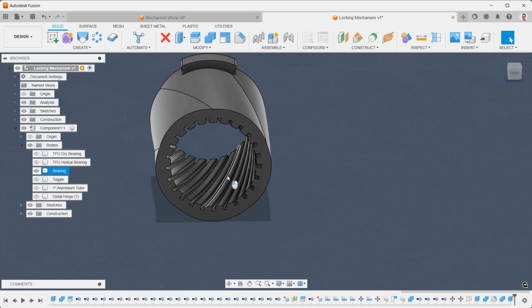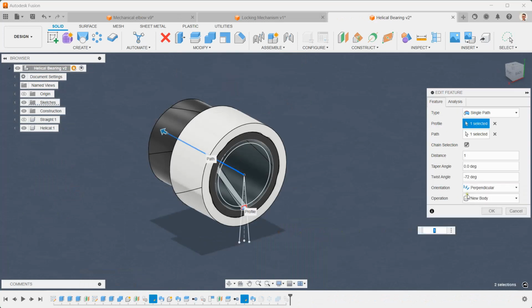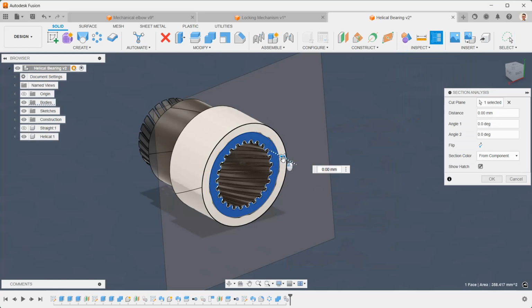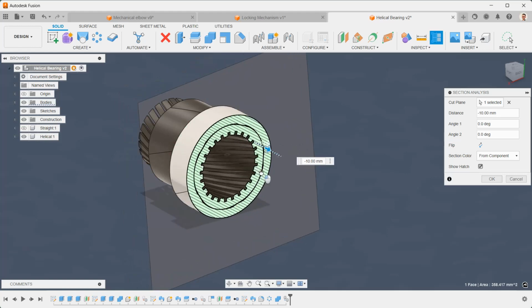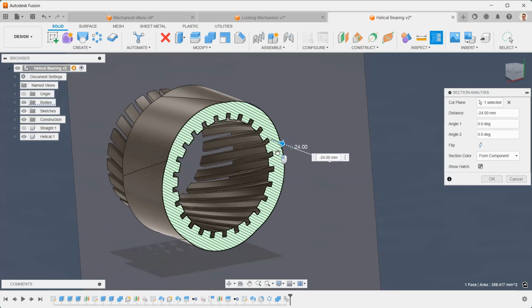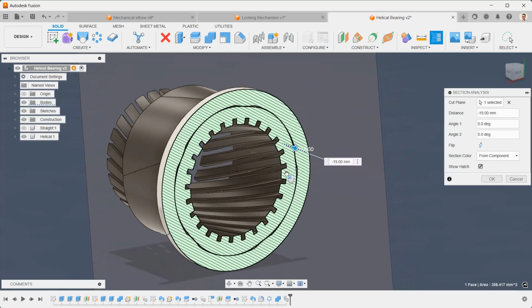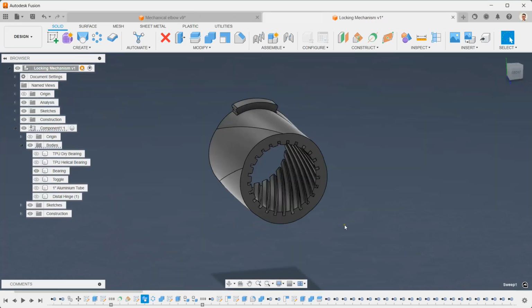Now, the thing that was going through my mind this morning is, what if I switched this pattern around? Would that work? If I changed these to run counter to that, am I just being silly now? So I had a look at it and couldn't see any particular benefits, but that's something to consider. At the minute we have these working on a twist angle on the sweep path of minus 72 degrees. What if I just did it 72 degrees so that the cam lobes were going one way and the splines inside the linear bearing were running the opposite direction? So that's something I could possibly try.